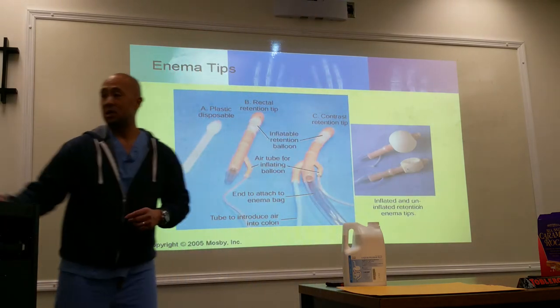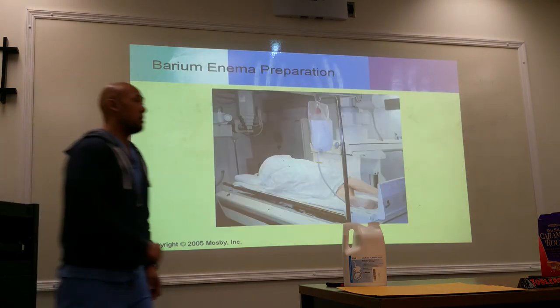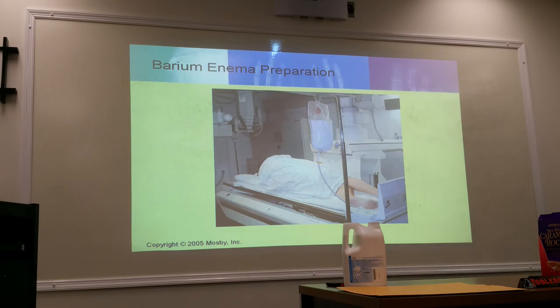The other thing that you are going to be doing as technologists is controlling the flow of the barium. So you're going to be standing here with this clamp, a hemostat. There is a clamp here that you will be clamping off and on during the procedure. The clamp is going to be closer to the bag, not near the patient's rear end. So we're going to move this closer to this end over here.